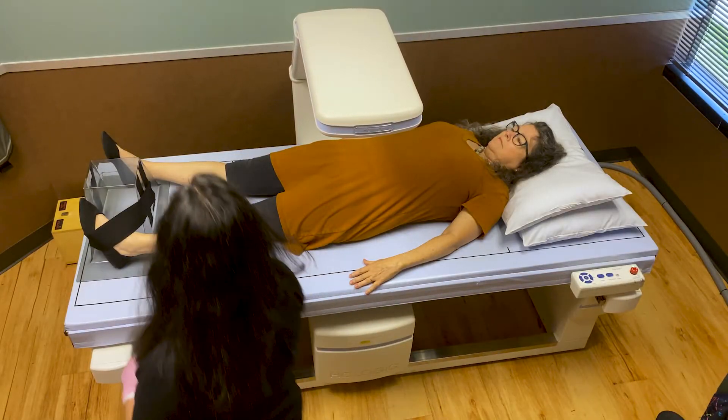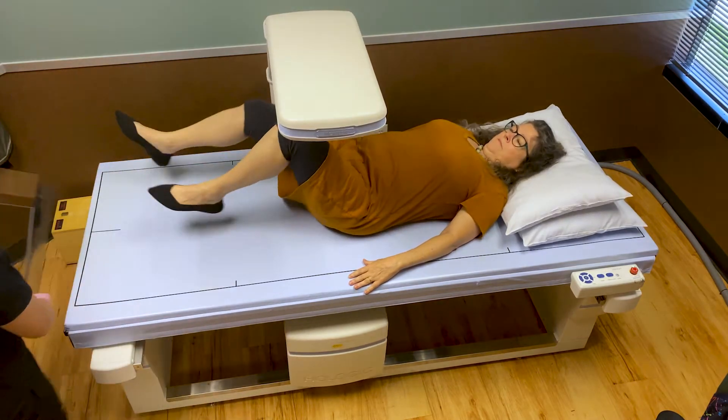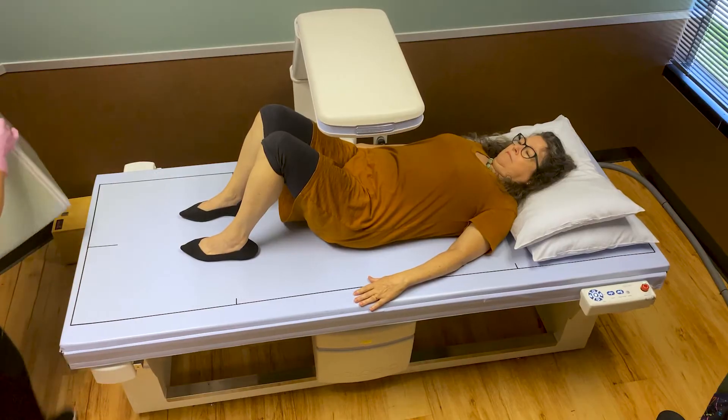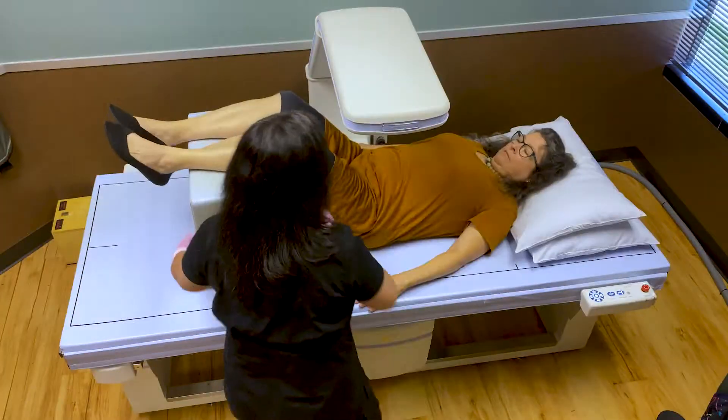All right, we're done with your first exam. I'm going to unstrap your foot and lift your feet a little. The next exam will be of your lower spine. I'll have you bend your knees and lift your feet up high, and I'll put a cushion underneath here for you.